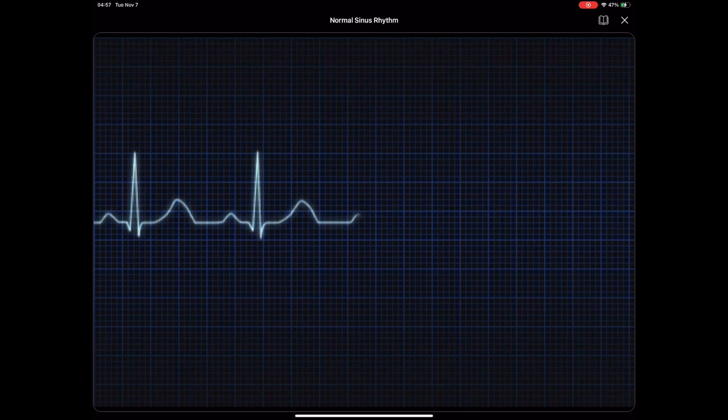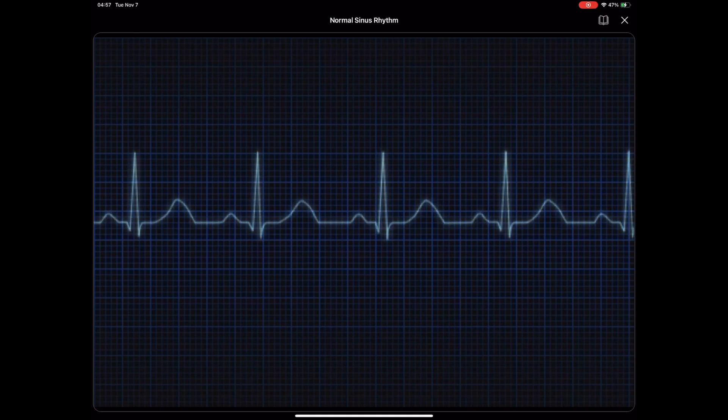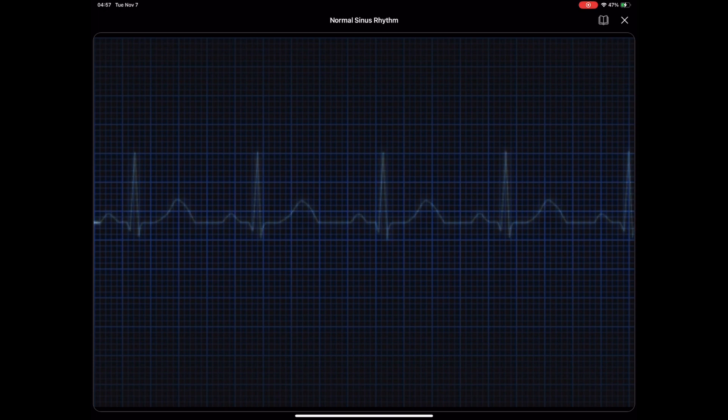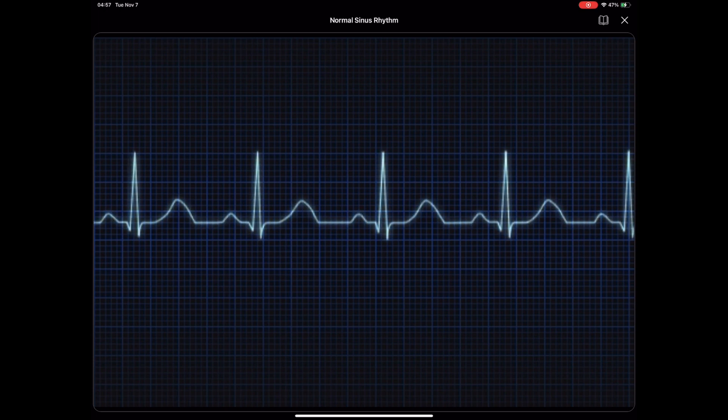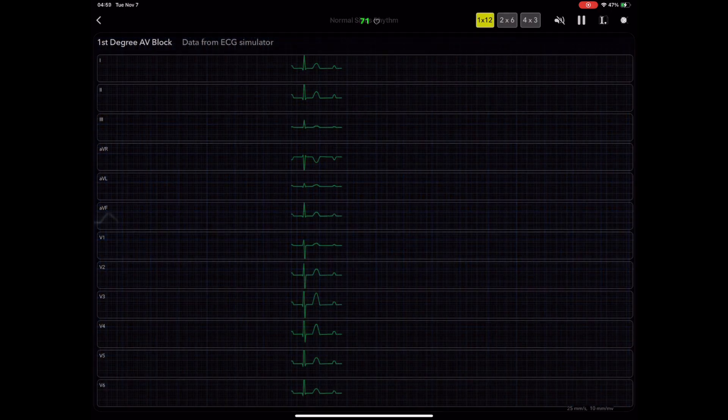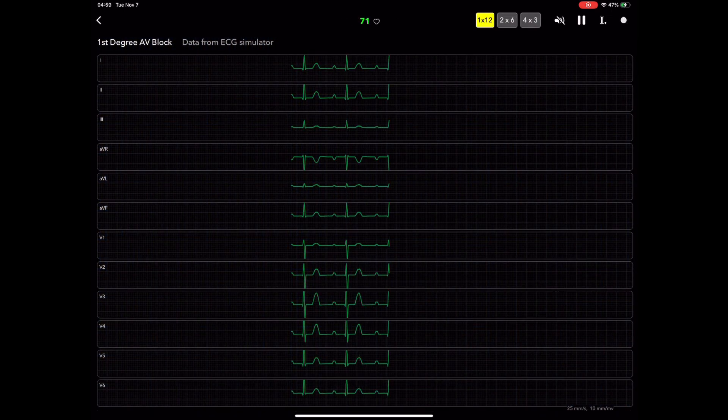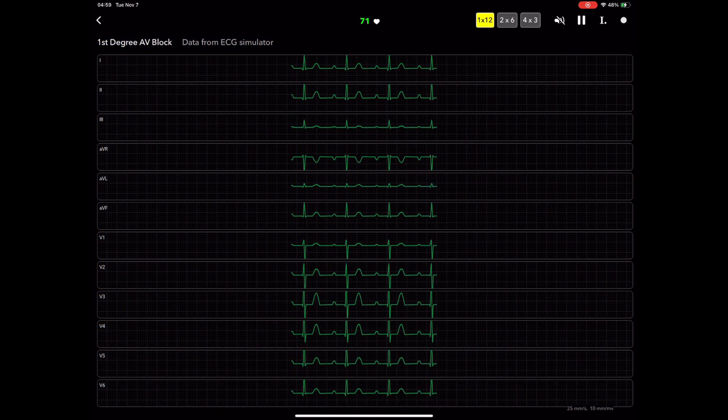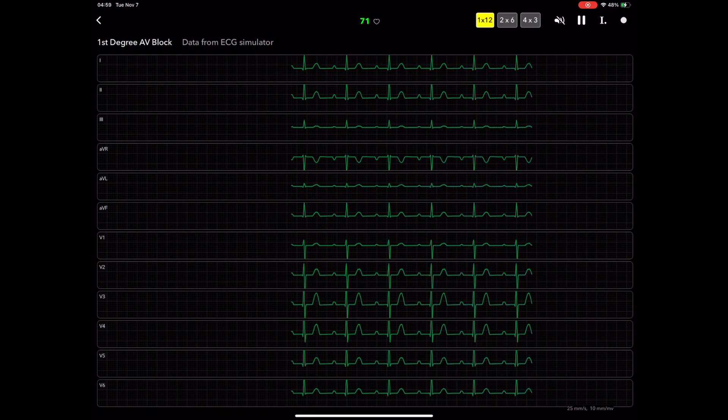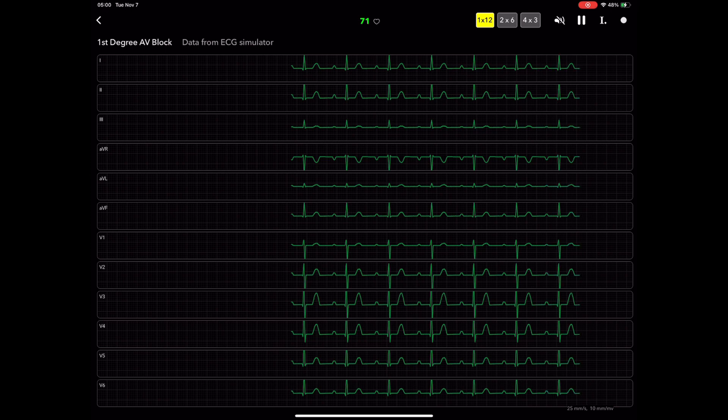Through concise explanations and illustrative examples, this course will guide you in recognizing normal P-wave morphology, identifying variations, and interpreting abnormalities such as P-wave axis deviation, enlargement, and duration changes.